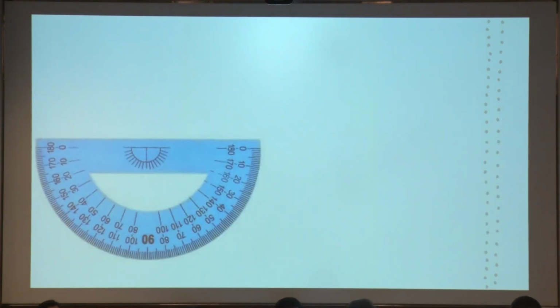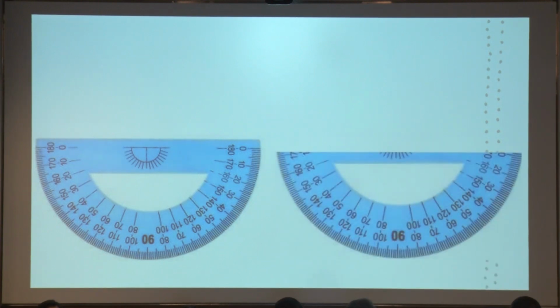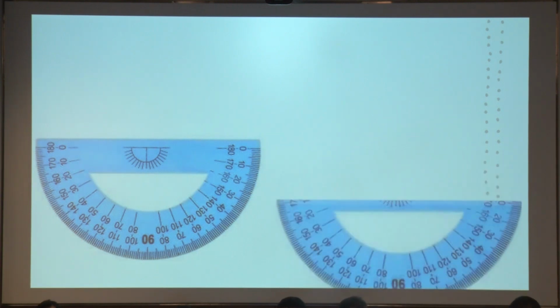Sometimes I found constantly wrong readings on my manual marking system, and I saw that my manual marker was not a full circle, it was a half circle, with a 10 degree lag, and in one marker I saw that it was not absolutely horizontal. So you have to check whether your instrument gives you a consistent result. And it is a common mistake by all manufacturers who make these markers.